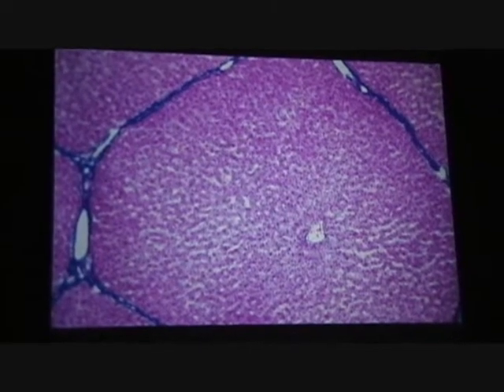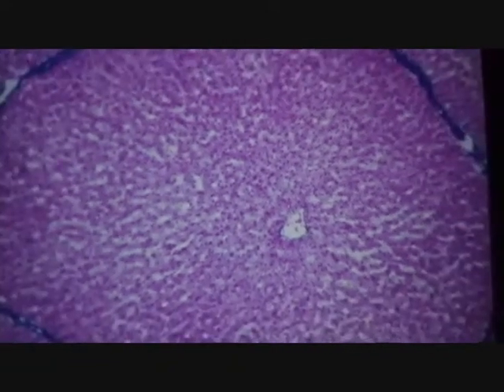This is actually from a monkey. Actually, it's easier to identify the substructure in monkeys, even pigs, compared to humans. But what is it? You hope to get all of them like this next week. Liver slides.